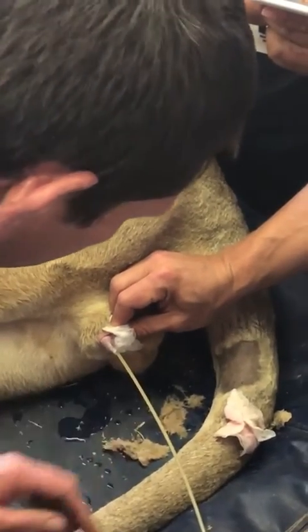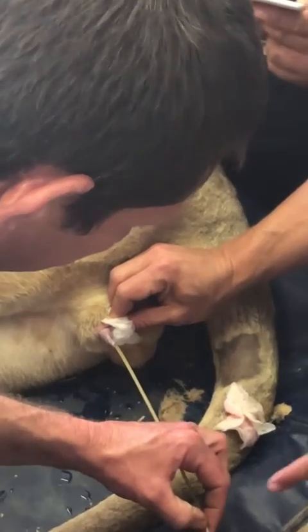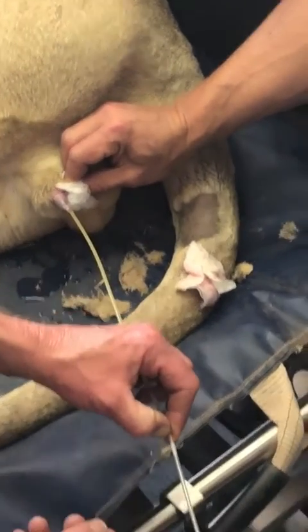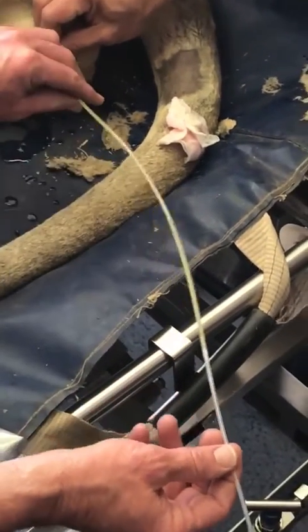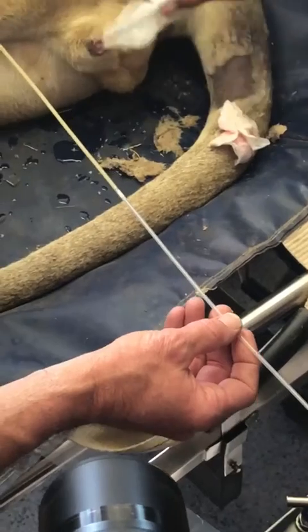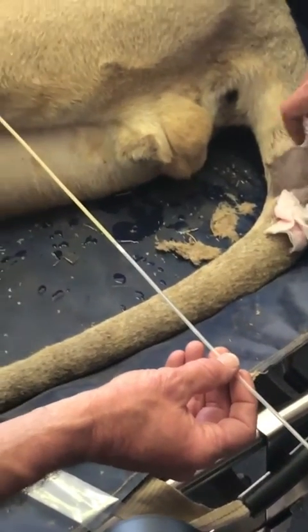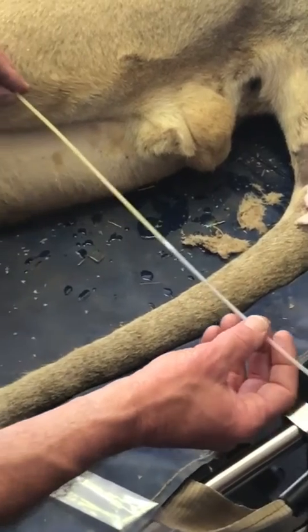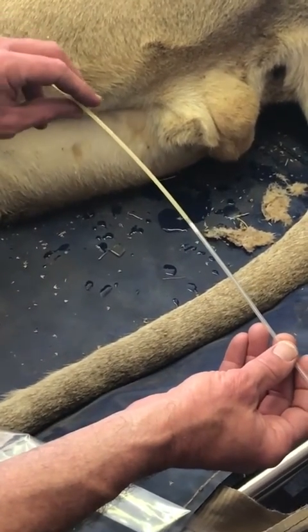Yeah, close. Now, there's your semen. Is that all you need? Xavier? Yes. Is it urine? You'll see what happens now if you watch it closely. There's the semen at the back — beautiful — but there's a bit of urine. Can you see the other stuff of the urine? The yellow stuff. Awesome.